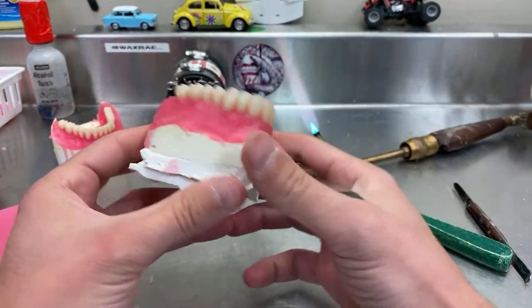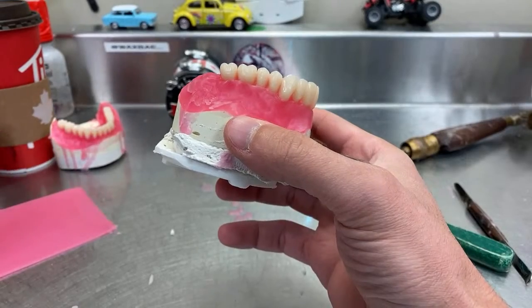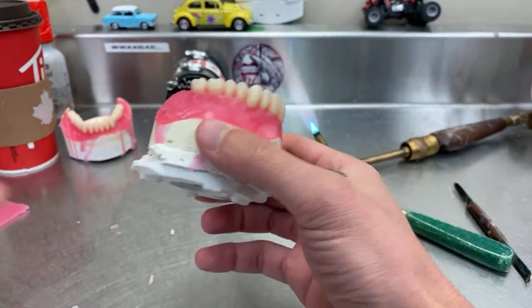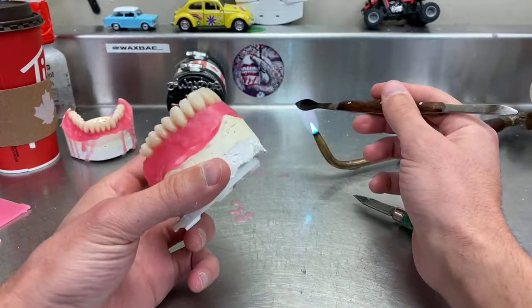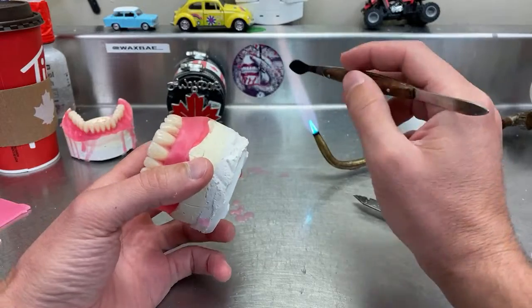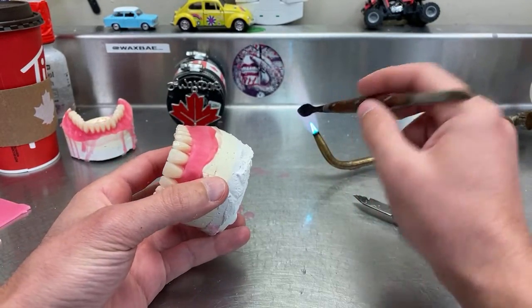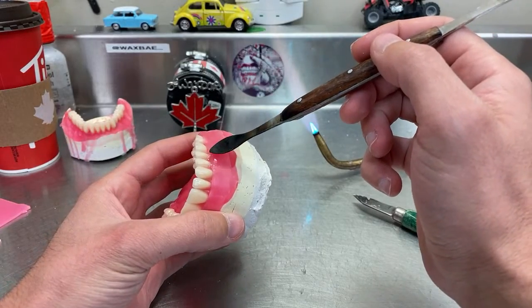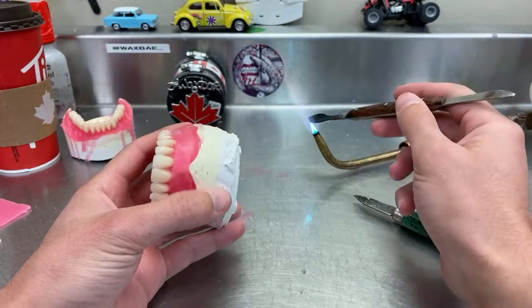So this guy was asking me why I don't use the wax sausage. I don't know if you guys are familiar with that. And I said, after this process, because this will fill most of the low areas. And then after that, I'll start adding the wax to the areas where I need it. And that's when your festooning starts to take shape. Because you cannot just start carving in a block of wax. You need something to help you, so you'll lay wax nicely.